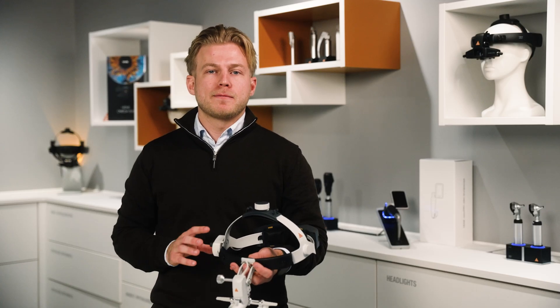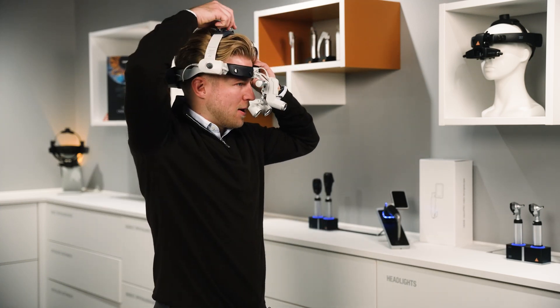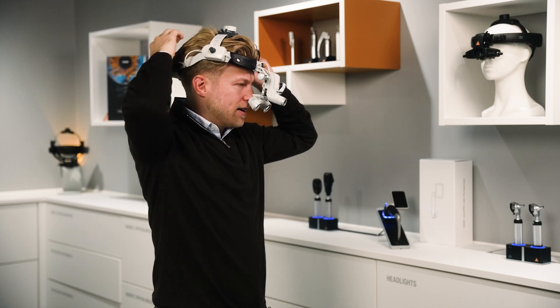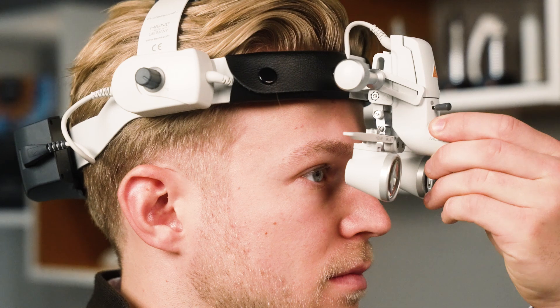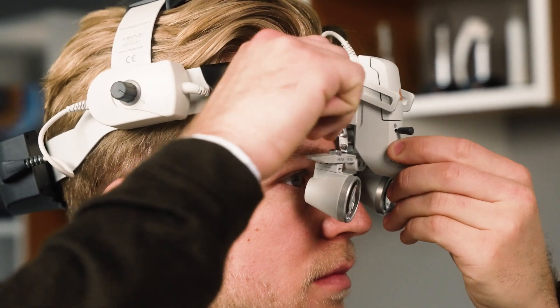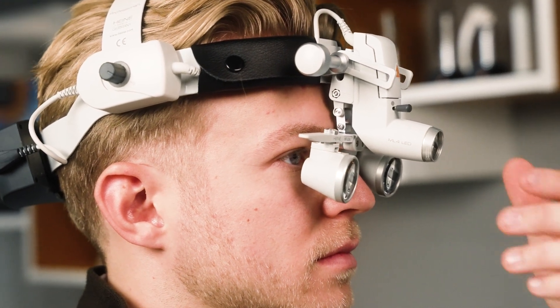Now let's start with the setup. We'll begin by placing the ML4 on our head and using both rotary knobs to adjust the fit. The headband should be placed on the top of your head and rest against your forehead. Move the loops and headlight on the rail as close as possible to your eyes. As the main fixation screw is still loose, you can move this freely. When doing this, we recommend holding only the housing of the light.